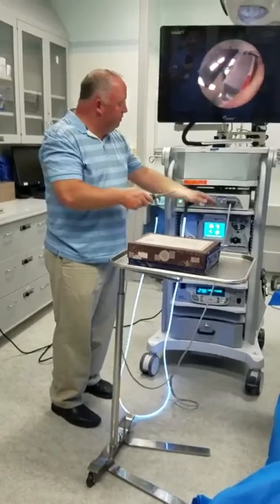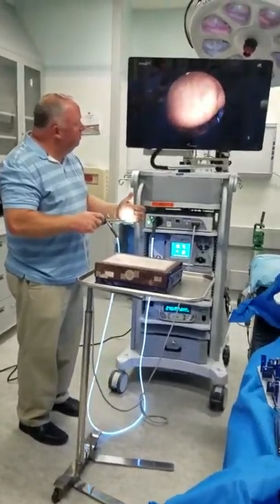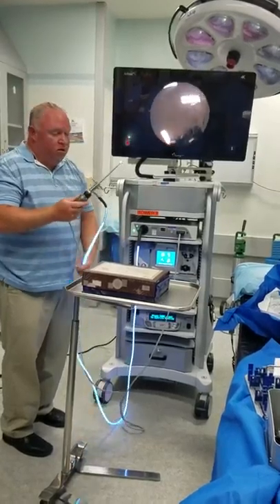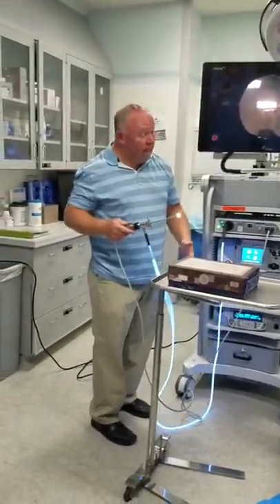That was what we needed. Okay, so now we're going to white balance. Okay. Now we actually can go inside. So here, yeah, I should have light.